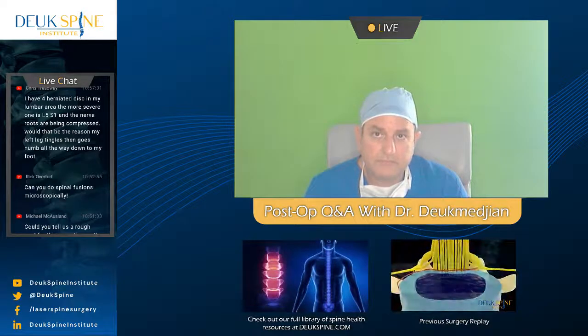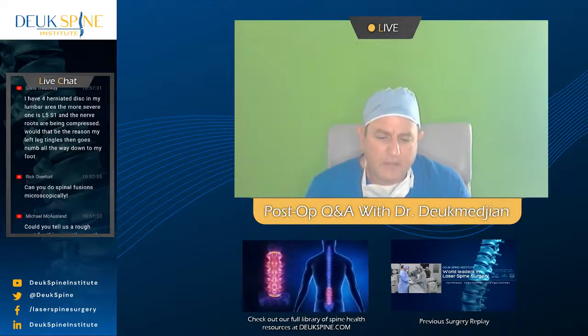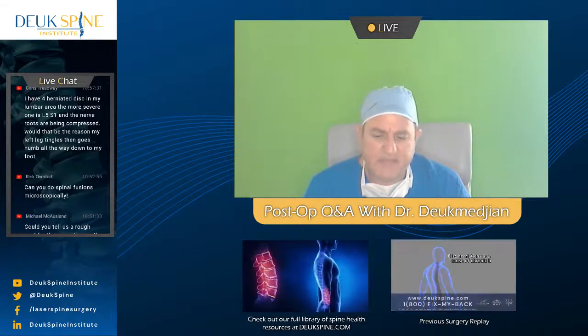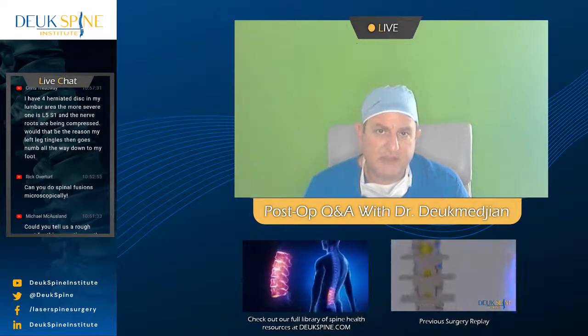So the first question is, can you do spinal fusions microscopically? What I think this person is really asking is about the endoscope that I just used, that little metal tube that looks like a McDonald's shake straw. I think you're asking me, can I do a fusion with that tube? The answer is yes, I can.